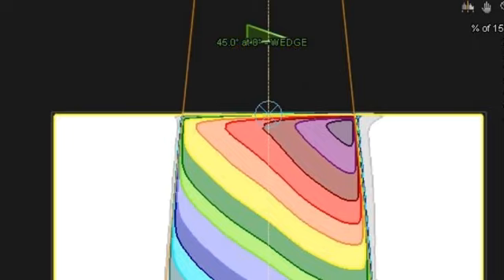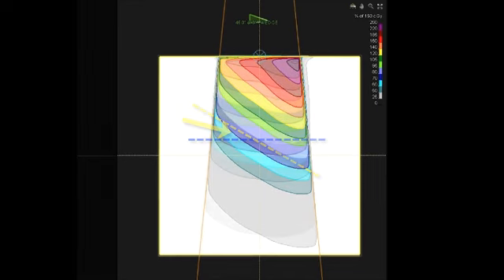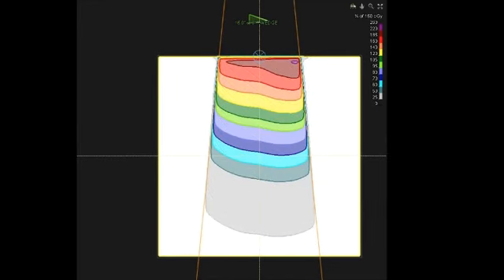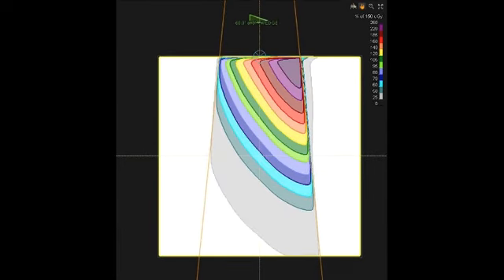We often talk about the wedge angle. That is defined as the angle through which this isodose line tips relative to the horizontal. So a higher angle wedge is essentially just thicker at the heel than at the toe. And so the isodose lines tilt more. And so here are some examples: 15, 30, 45, 60 degree wedges. You can put whichever wedge in that you need.